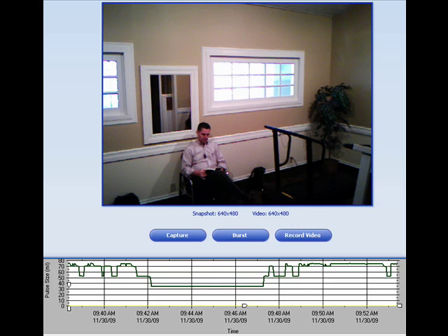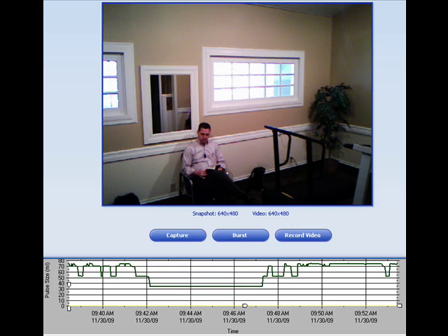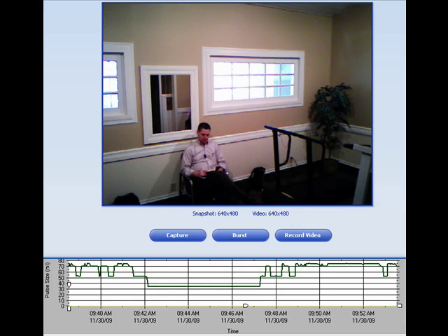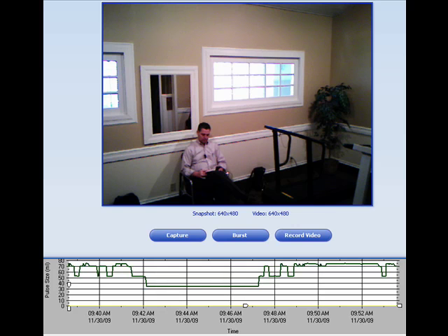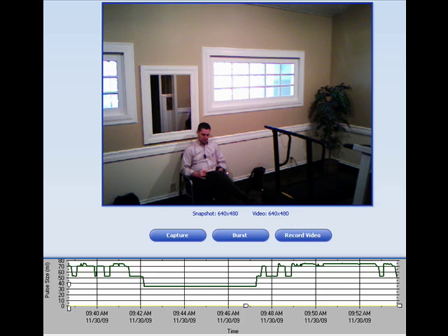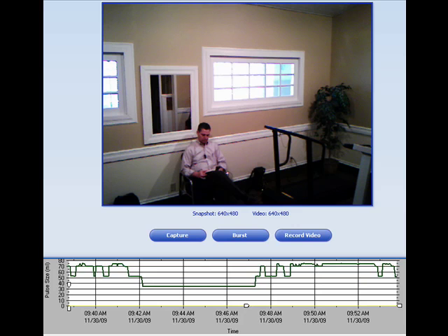No longer do your patients need to attempt to turn their oxygen up and down, trying to hit that elusive just right timing. And no longer will your patients have to stop exerting because they waited until they were symptomatic to turn up their oxygen, too late to be effective. And no longer will your patients run through oxygen while sitting because they forgot to turn it back down when they sat down. SmartDose does it all for them, automatically and consistently.